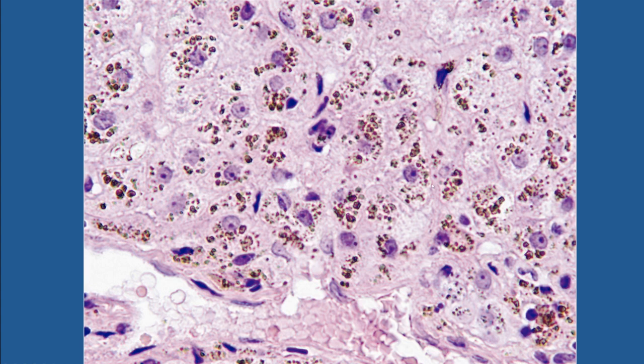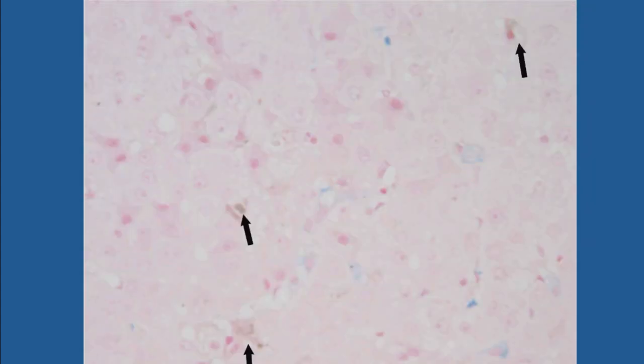So I've taken this picture with the condenser down to show the refractile nature of iron. But the best use of the iron stain to me is to detect the presence of bile, because bile is rather amorphous, lightly green stained material on your histologic preparations. And you may see that on an H&E, but you may not, because the staining is rather subtle.